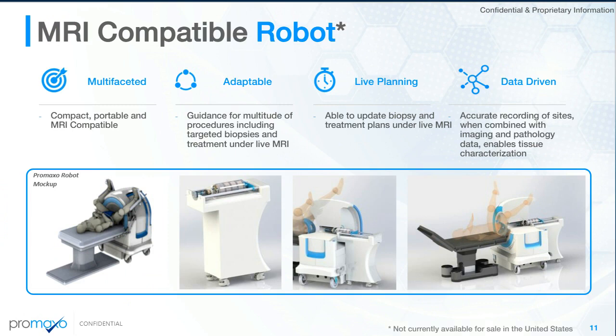And then lastly, the third leg of our system is our MR-compatible robot. It is multifaceted in that we can have different styles of end effectors attached to it for different treatment planning techniques. It provides live planning, meaning we're able to do the biopsy under live guidance, and we'll have, again, a component of AI involved with this that will help do data-driven path planning and tissue characterization.